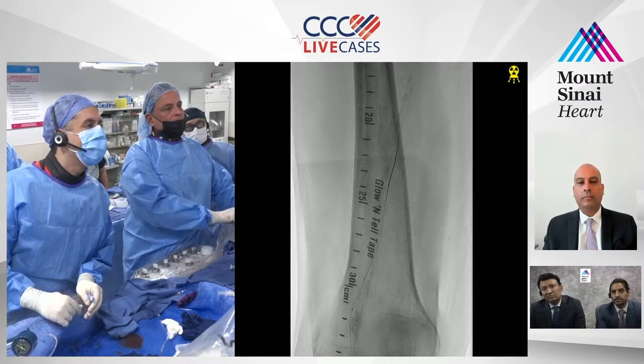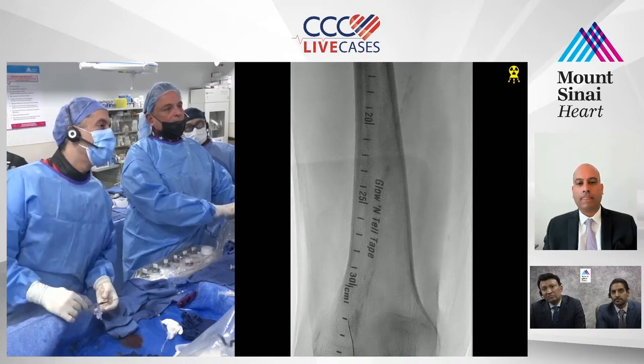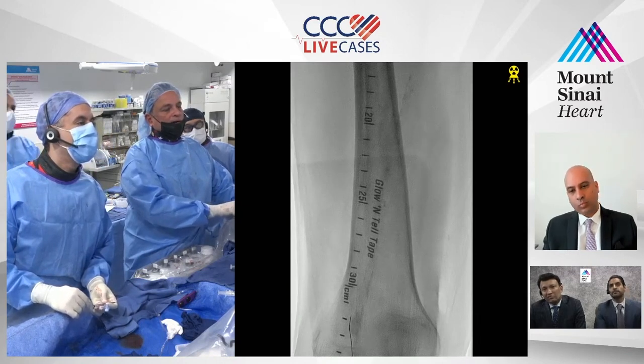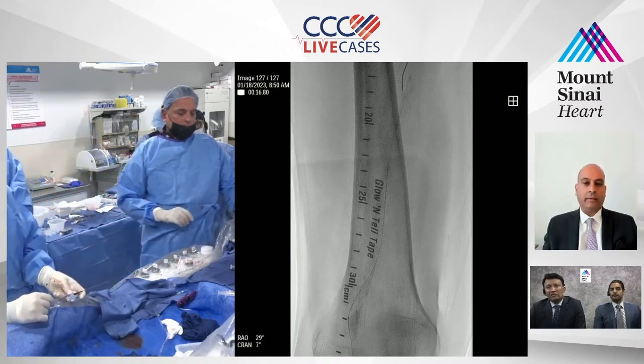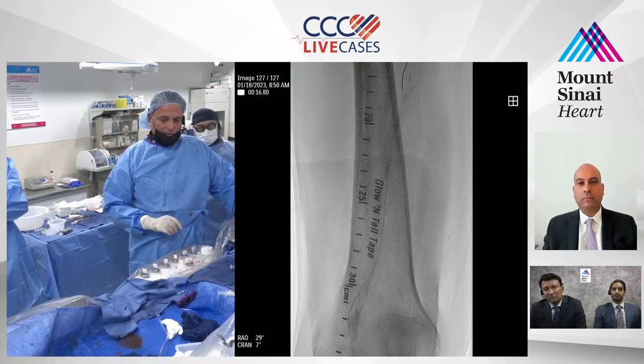Let me just push this up. Hold on, let me just try to see. Pull the wire completely back. Okay, sure. You probably need to be past the cap a little bit, right? Because otherwise it's just going to get stuck at the calcium. Right. Push the wire now. The wire has to be definitely there, past that. That's perfect. Now walk it back. Fine. We just wanted to get the wire in a nice spot before we try once more with the Outback.